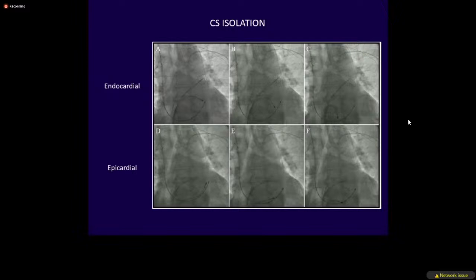Remember that you are close to the coronary artery, so no long lesions, no more than 5 seconds, and you move fast. Also make sure your catheter is never wedged anywhere. We still use high power. Otherwise, even with high power, moving every 5-6 seconds, you have significant reconnection after a single procedure. So do the most you can endocardially along the CS.